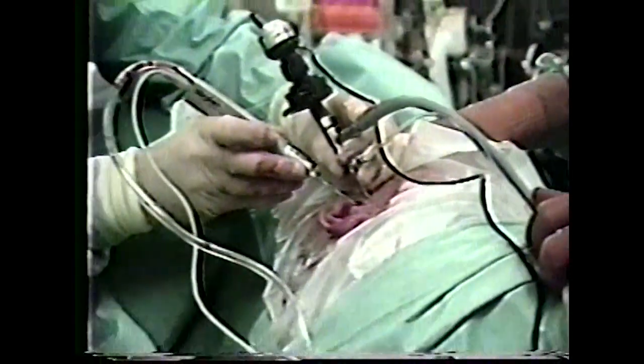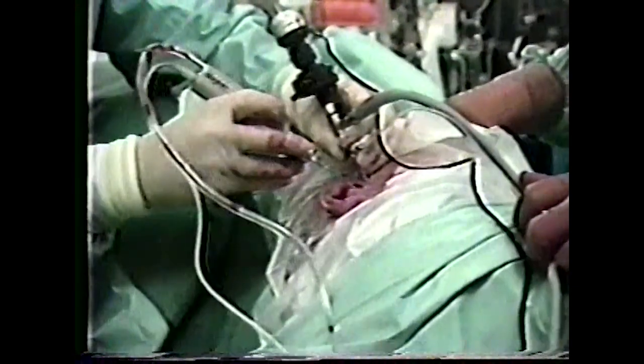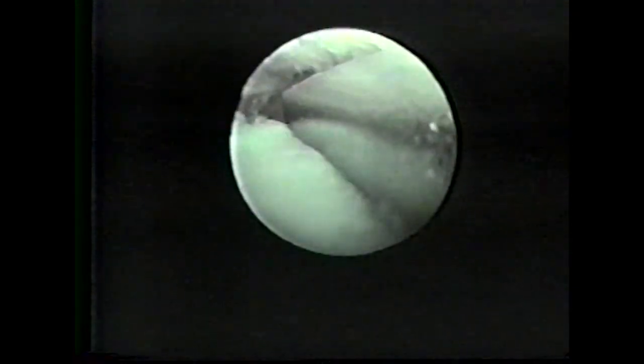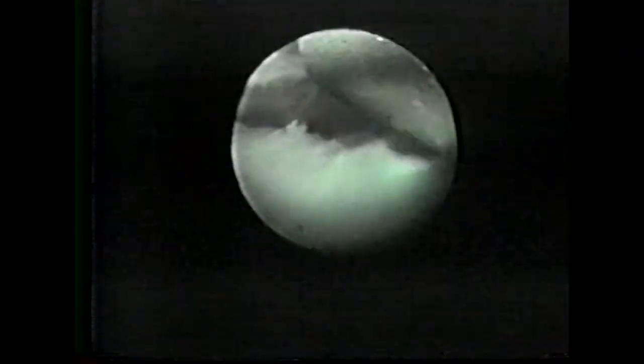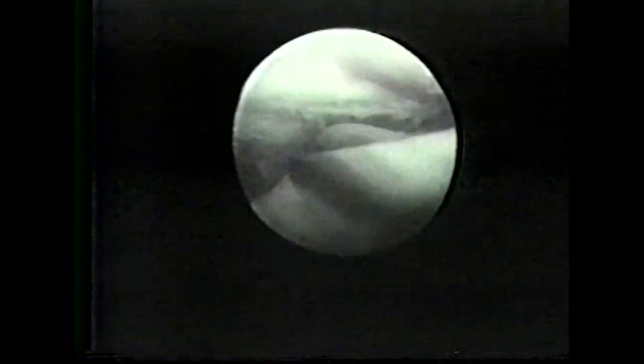The power debrider is particularly useful in removing fibrillated tissues rapidly. Here, we can see the microdebrider using a full radius cutter to help shave the fibrillated and degenerative cartilage from the articular surfaces exhibiting chondromalacia.